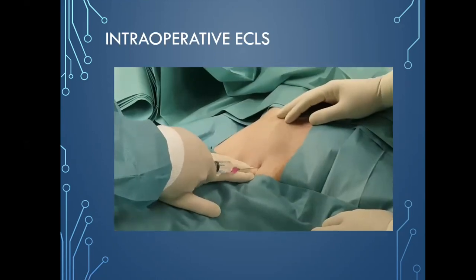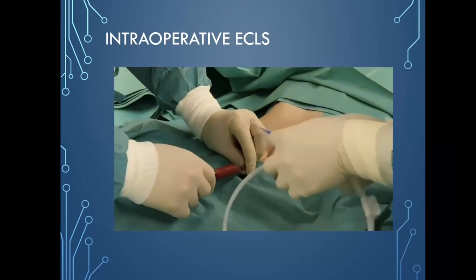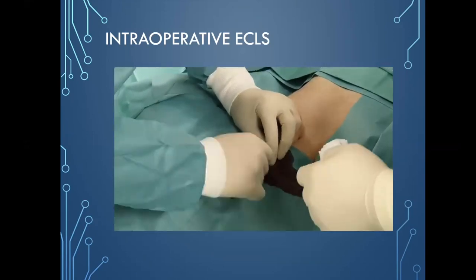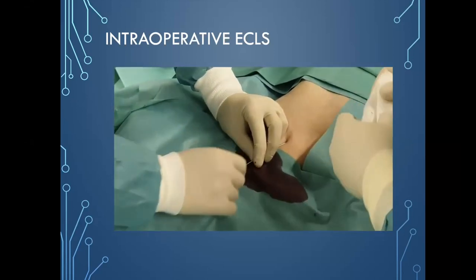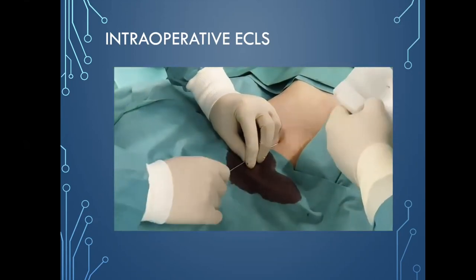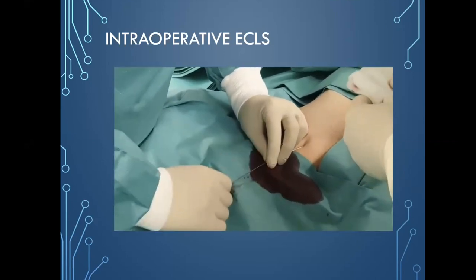It's really only a Seldinger technique insertion of the cannula. So here you see the vein. I mean, this is also a really nice case to see. It's a really skinny patient. And the most important thing is to make sure that your wire is going really without any resistance. So once you have any resistance, just cut it off and go for another puncture. Do not force it. If it's going smoothly, you're not doing anything wrong.